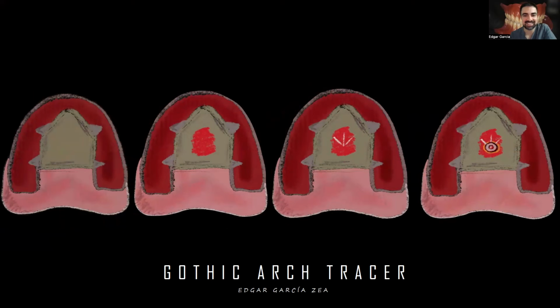Right. Let me ask you a good question. Let's go back to your patient before you printed the denture. You have the upper tray with the border molding. You get the vertical dimension, you put the lower tray, border molding, making sure that you got the vertical dimension, you border mold the lower one. Now you have your vertical dimension. You could have a second tray with the Gothic arch. You put it at the same vertical dimension, you have the patient go back and forth. And at that moment you could have accomplished this step right here. Why did you decide to get the bite, fix both upper and lower rims, and then go back and do your Gothic arch?